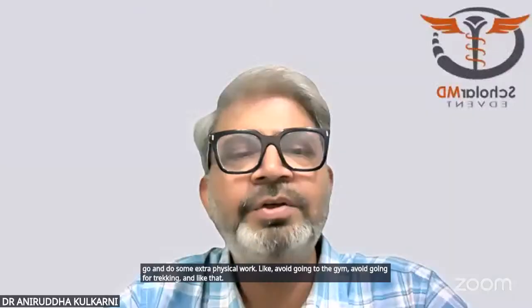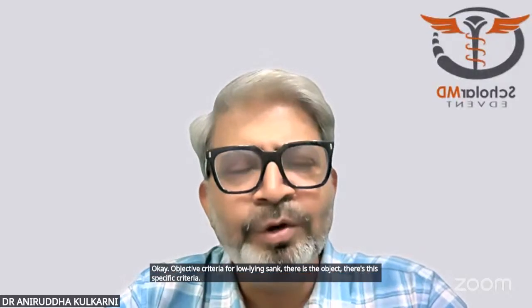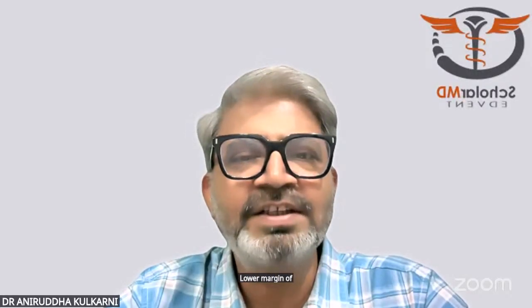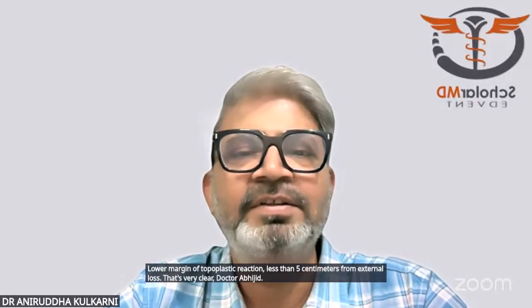Okay. Objective criteria for low-lying sac: there is a specific criterion. The lower margin of the trophoblastic reaction is less than 5 centimeters from the external os. That's very clear, Dr. Abhijit.